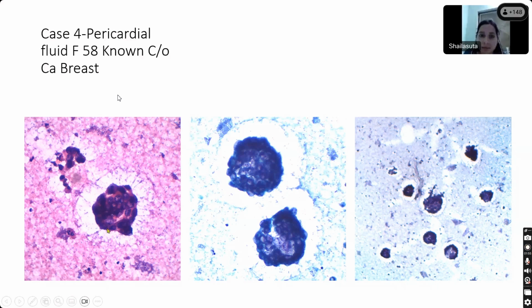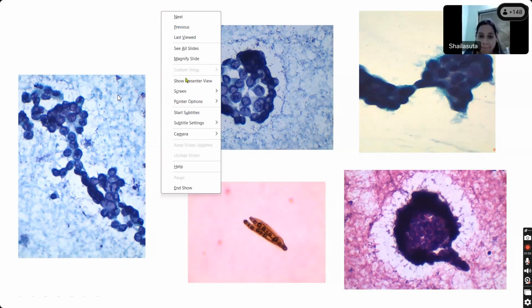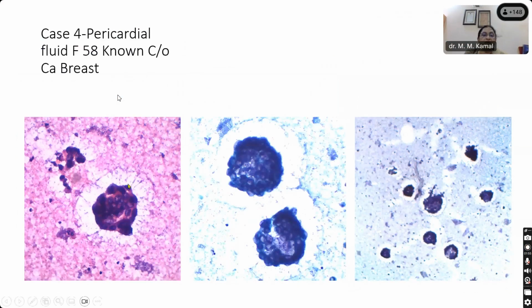You're talking about this halo. Okay, that's artifactual. But basically, ma'am, what you are seeing are cell balls. Cell balls and very tight cell clusters, and the cell nuclei are forming the borders. Yes, there is a hollow in the center. So there is a hollow in the cell cluster, which is very typical of such morulae or cell balls that come from carcinoma breast.